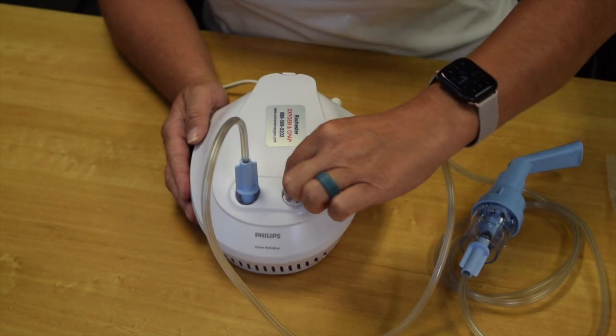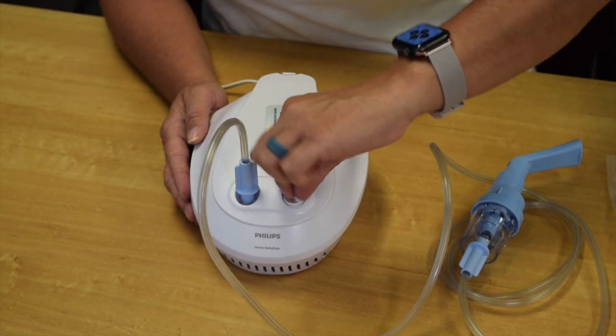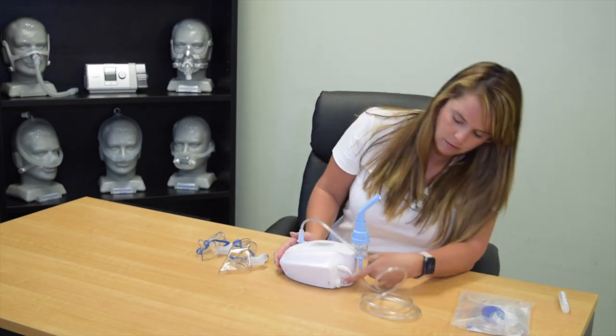There is a filter on this compressor. Removing that was just a turn. This is good for, really it's dependent on how it looks. So if it gets dirty or wet, then you're going to want to change it. You will contact your DME company when you need more of these. So then you just kind of put it back in there and turn it until it clicks. Like that. Your start-stop button is on the back here, right there.